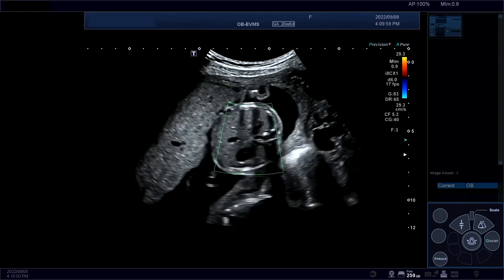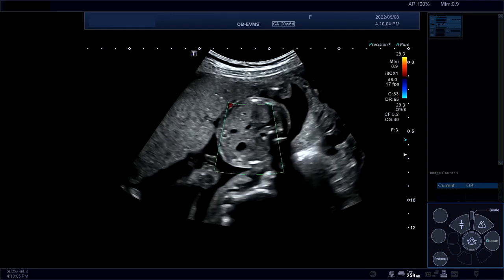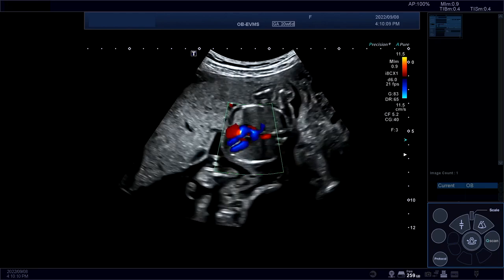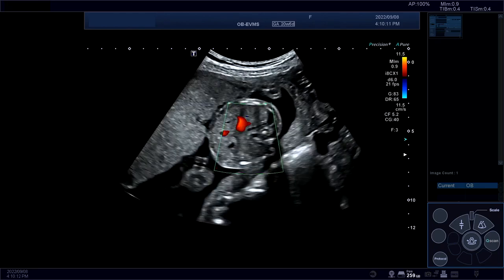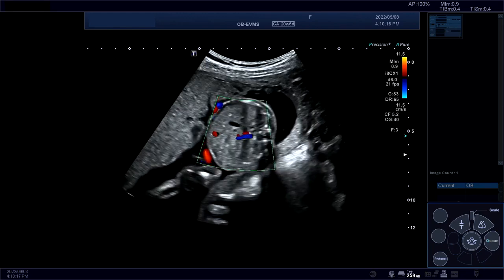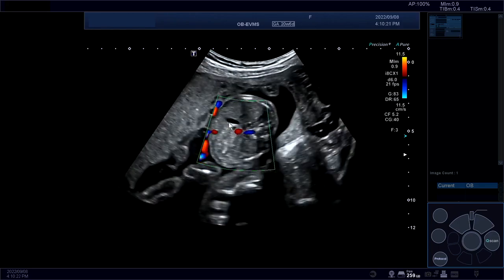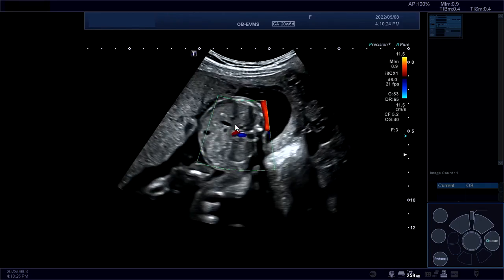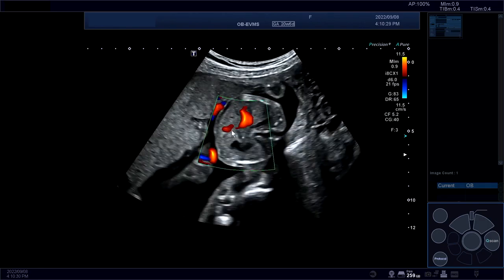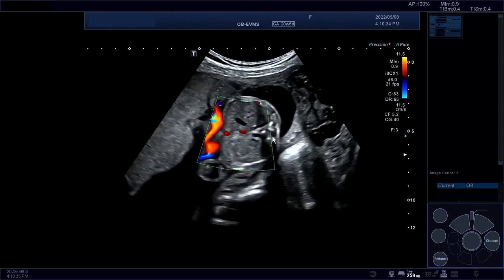So I am in the cardiac, no, I'm in the OB package. Okay, so let me reduce the velocity of the color so I can stay in the abdomen a little bit, and I'm going to look at the curvature of the portal sinus here, and I see the gallbladder here. Again, with color Doppler, you see no blood flow in the gallbladder, and that tells me that there's a normal curvature of the portal sinus. Tomorrow, I'll show you the anatomy of the venous system in the stomach and how you can diagnose abnormalities related to that.